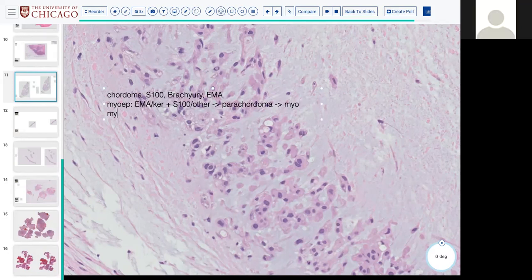I was going to say, I have a completely just academic only question. We're talking about it not being like lipoblasts, not being lipid. I mean, what is within these? Do we know what the material is, or speculation? That's an excellent question. Like, is it PAS positive? Has anyone ever even? I do not know. That's a really good question. If I find it, I'll let you guys know. If you find it, let us know. Sounds good. It sounds like a plan.